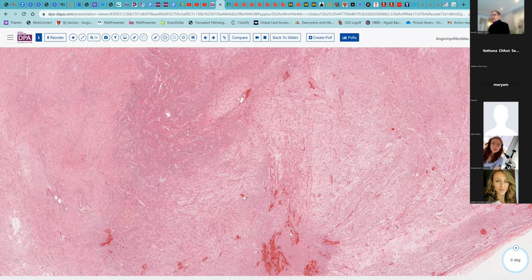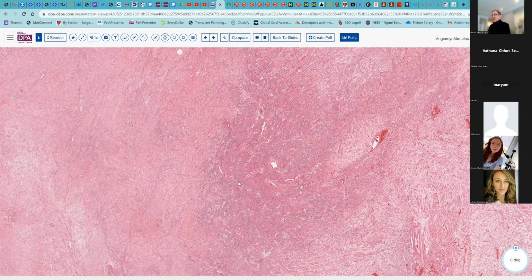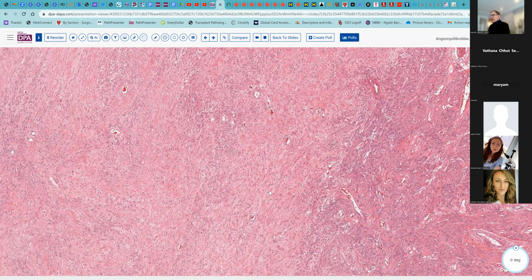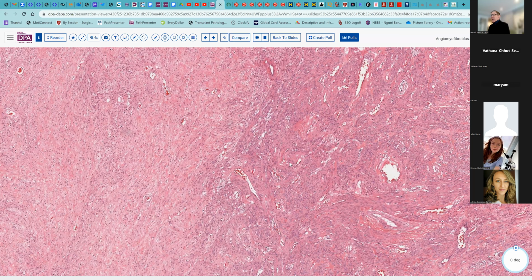But as you look at this lesion, I think you'll appreciate that there is definitely a more myogenic appearance to this. You can see there's more pinkness to the cytoplasm, and this lesion will have desmin positivity. The smooth muscle tends to cluster, sort of ball-like around the vessels.